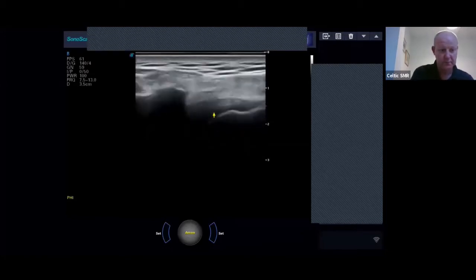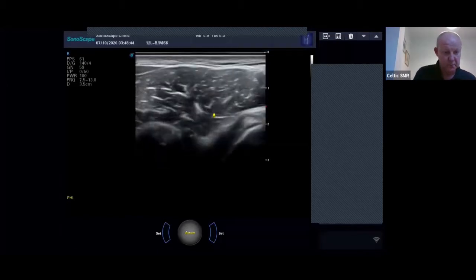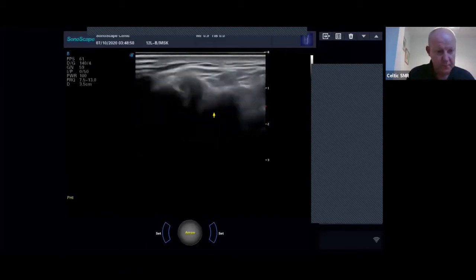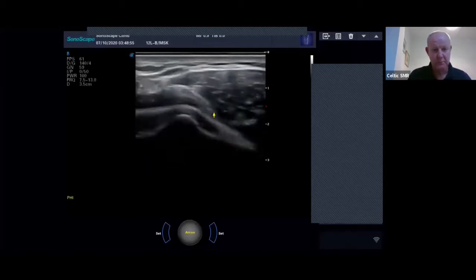And that's really my shoulder exam. I mean, I've been looking for, you know, sometimes you can pick up lipomas and cysts, ganglion cysts and things that come up from the joints, and lipomas in the fat layer and stuff like that. I've got one just there.